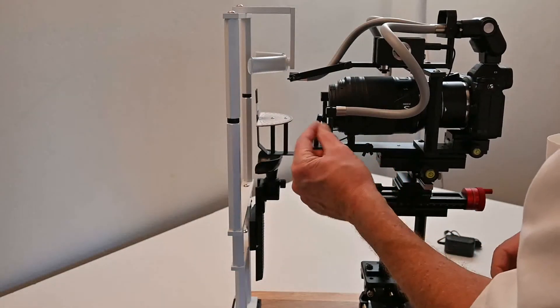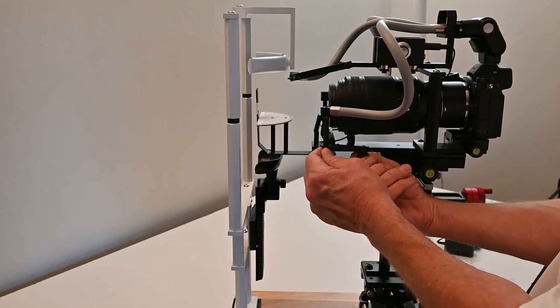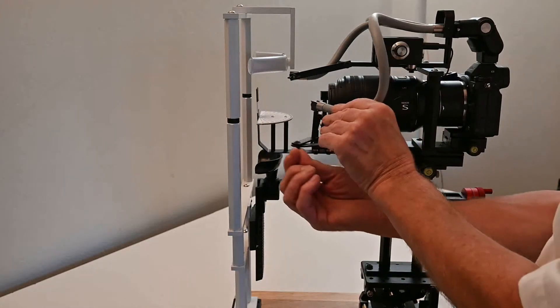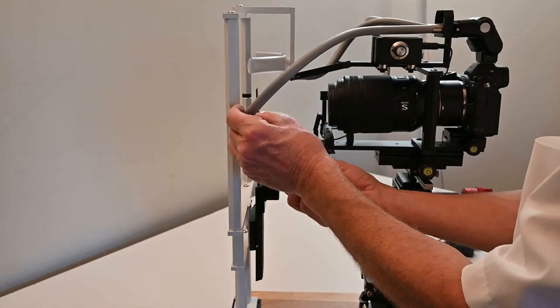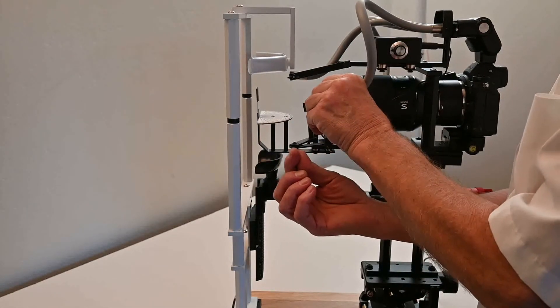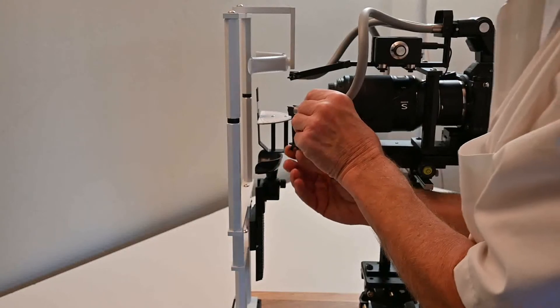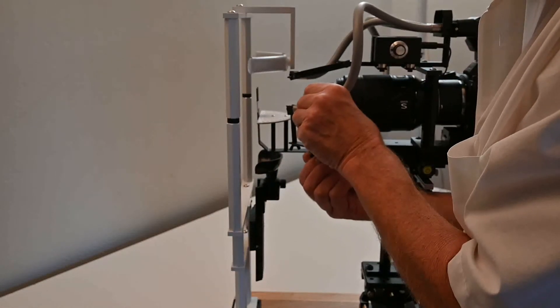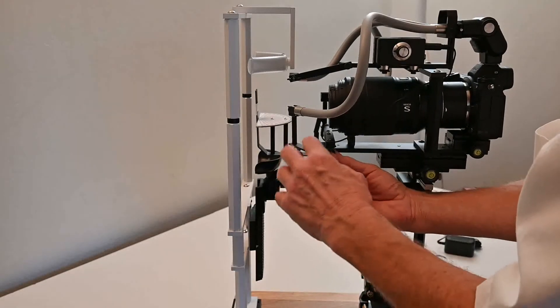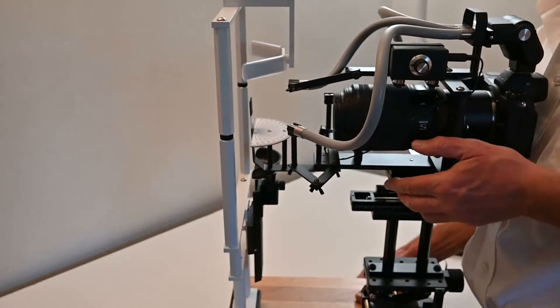To adjust the angle, loosen the three screws just a tenth of a turn — just a notch — and it allows placing the light anywhere needed: 90 degrees, far back, or anywhere in between. It's better to keep the light close, about three inches from the iris. The reference starting position is 45 degrees, about three inches from the eye. Tighten all three firmly.